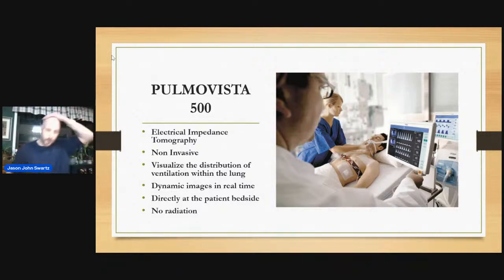Okay, so the PulmoVista 500 is an electrical impedance tomography. This is a non-invasive monitor that helps you visualize the distribution of ventilation within the lung. It gives dynamic images in real time, and all of this is done directly at the patient's bedside.